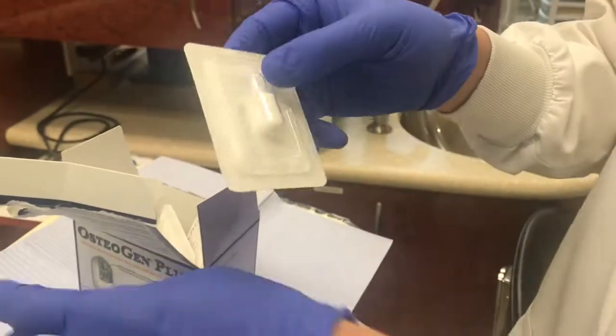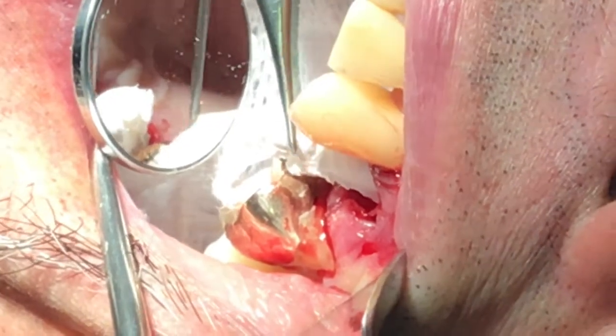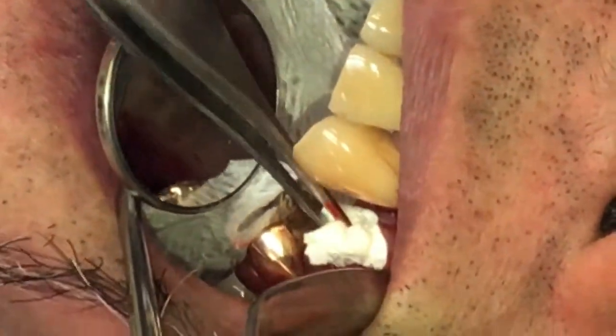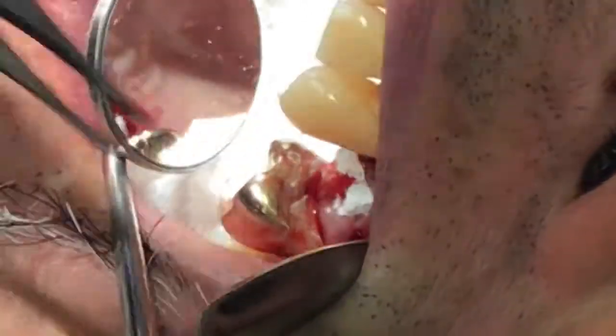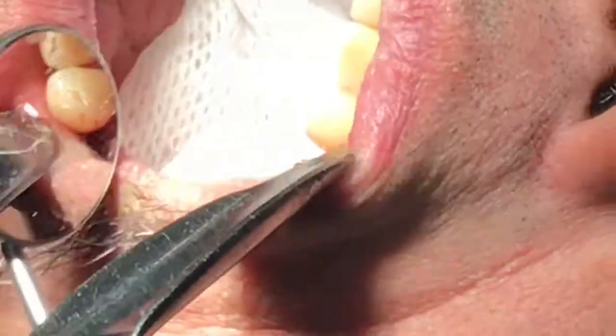This is the OsteoGen Plug — it works wonderfully. You cut it in half, put one half on the buccal root and one on the lingual root, and compress them all the way down. Within a few seconds you can see the bleeding stops completely, and you're ready to suture.